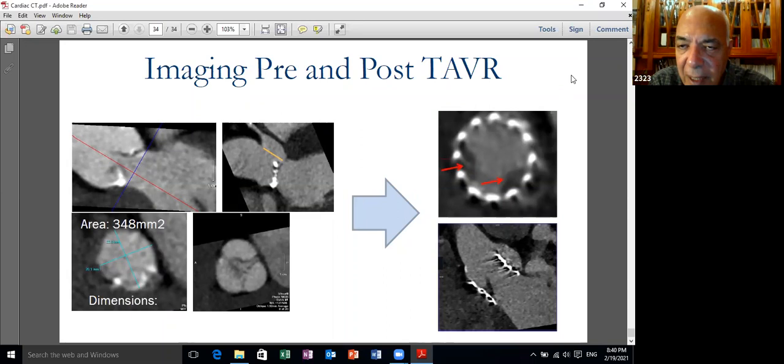But we know that calcification is part of the plaque, and if you have dense calcification and the patient has symptoms, then he probably has a significant stenosis, so he should be angioed. Under these circumstances, you have to decide ahead of time whether you are going to go to invasive angio, or, because of the extensive calcification, you predict that the coronary CT is not going to be very helpful. But it's not a contraindication.